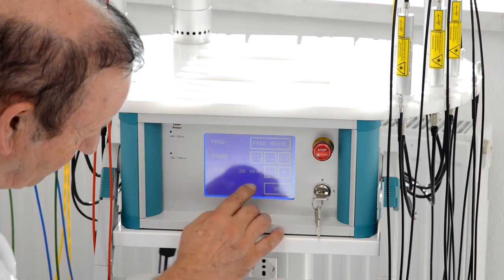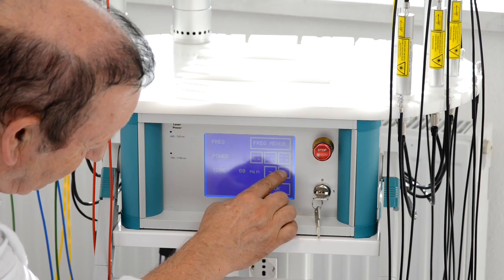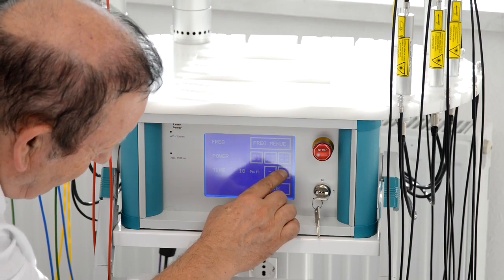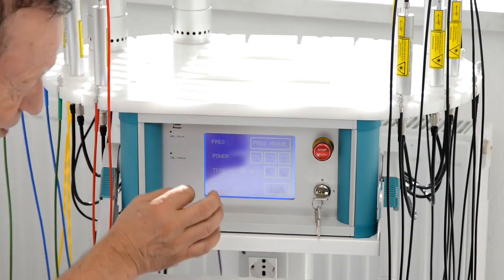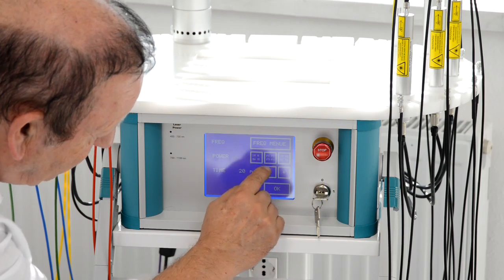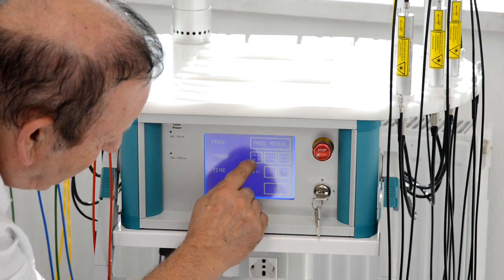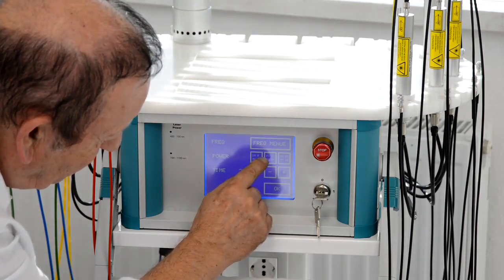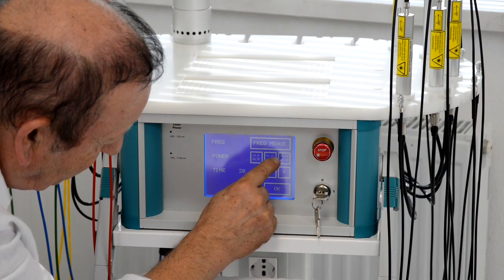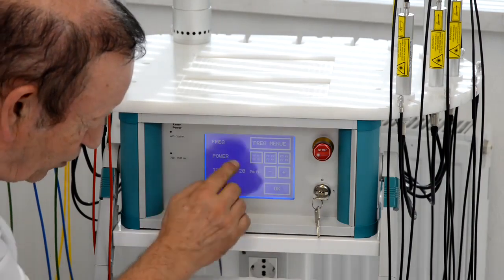In the set mode now I can change the time, up to 60 minutes. I go back to 20 minutes. And I can change the power of the different groups of the device. We have 3 groups in total, between 1 and 100%. So in the first group we find the red, green, blue, and in the second group we find the ultraviolet and the yellow one, and 2 of the infrared ones, and in the third group we find 4 additional infrared ones. So now I show you how to change.